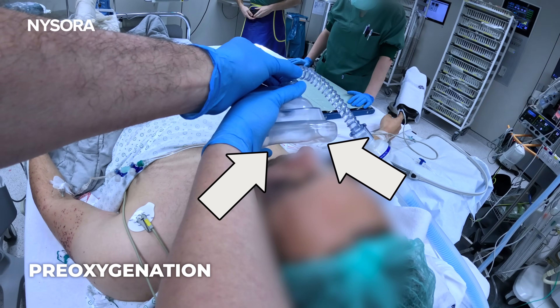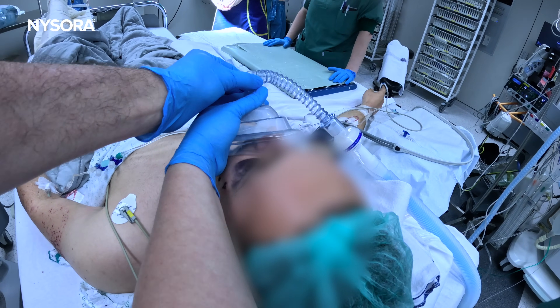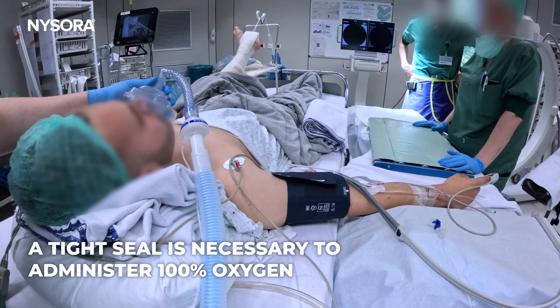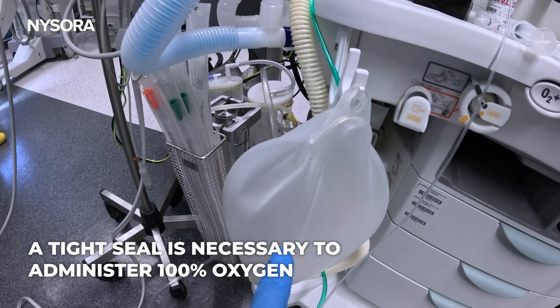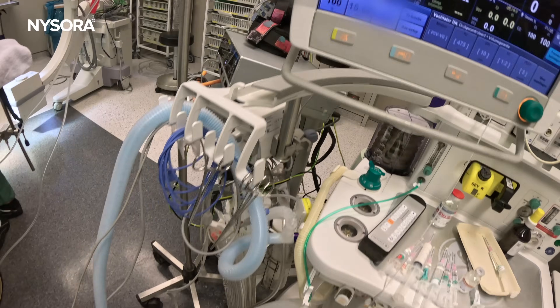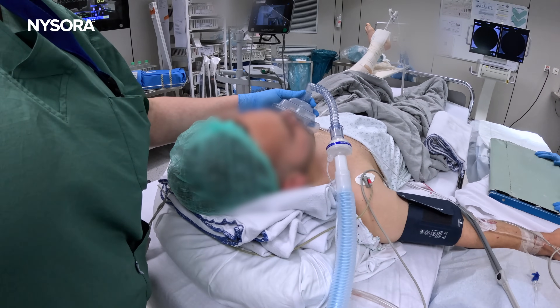Oftentimes, oxygen is given like this. However, this does not provide 100% oxygen. 100% oxygen only comes when you actually have 100% face mask fit, so that everything the patient inhales is 100% oxygen. Otherwise, the patient is breathing entrained air, which reduces the oxygen.